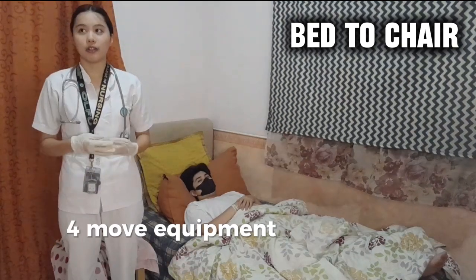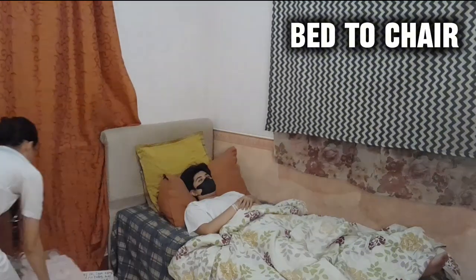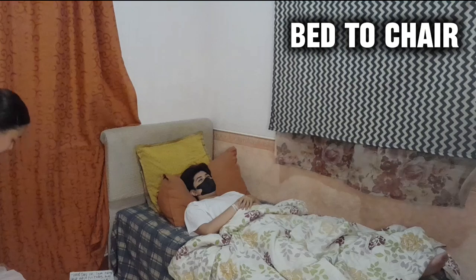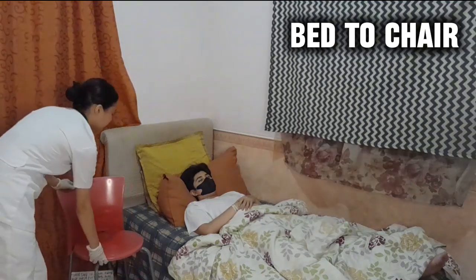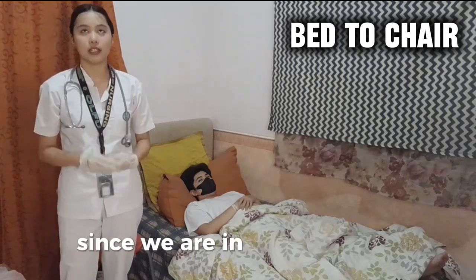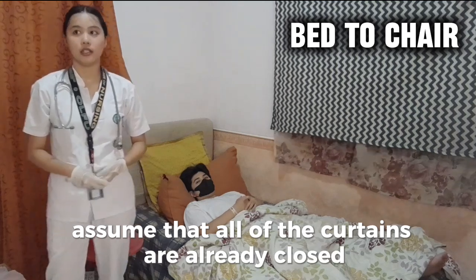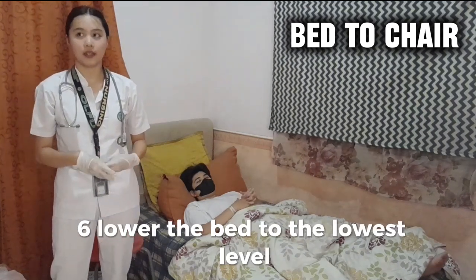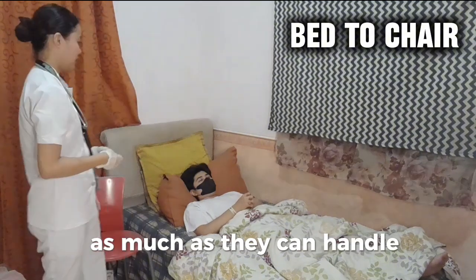Fourth, move equipment if needed to make space for the chair. Next, close the curtains for privacy. Since we are in a private room, assume that all of the curtains are already closed. Six, lower the bed to the lowest level. Raise the head of the bed so the patient is sitting up as much as they can handle.